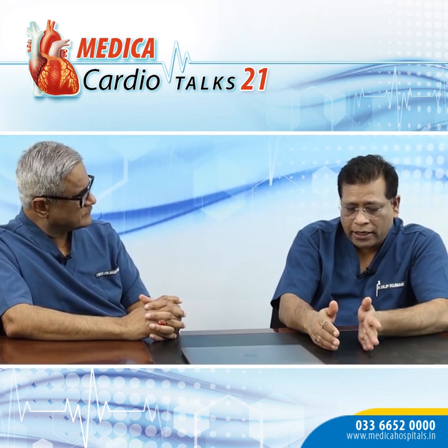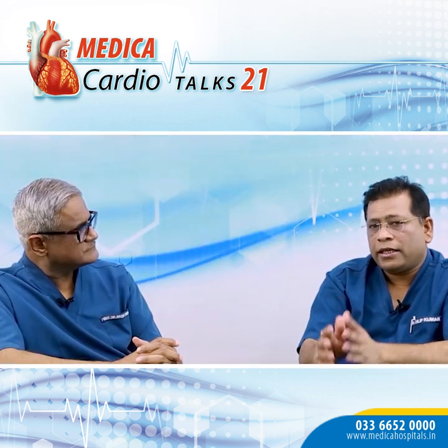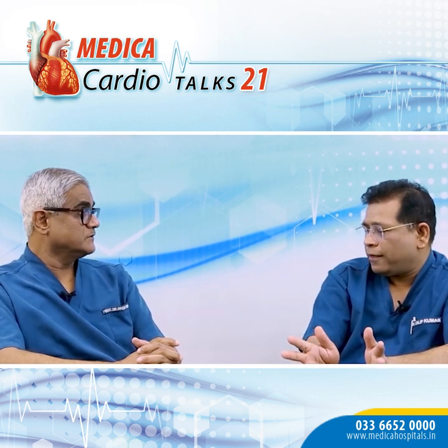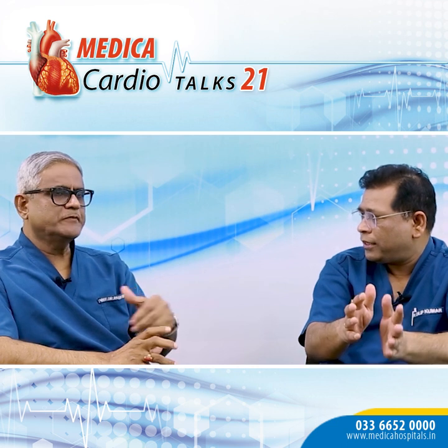So once these patients are at high risk for surgical intervention, then percutaneous intervention comes into the picture, and we have 5 options. The first and foremost is clip devices. We had a huge experience with clip devices because people are doing mitral clip for mitral regurgitation. We correct that by putting a clip across the mitral valve, called mitral clip.